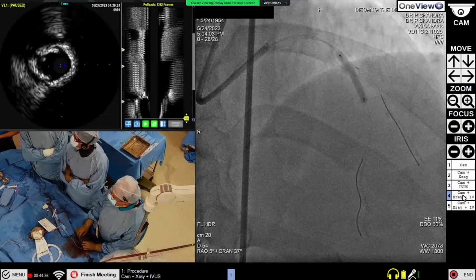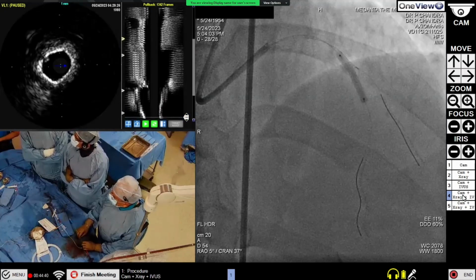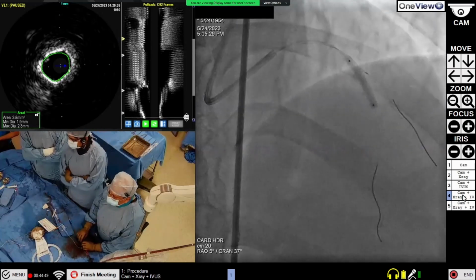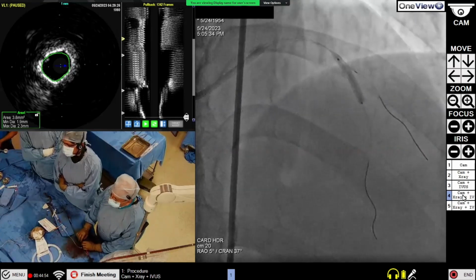1 minute 45. So this was again after that. Yeah, this was the point. Yeah, here, no, measure here. Okay, done. This was 3.8. So we have gone from 3.8 to 5.2. 2 minutes, okay. Deflate. Go down. Deflate, please.